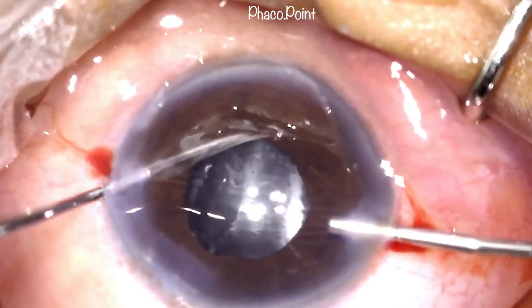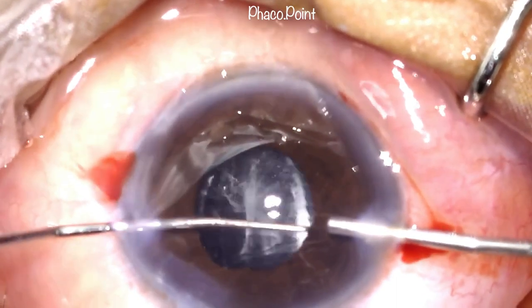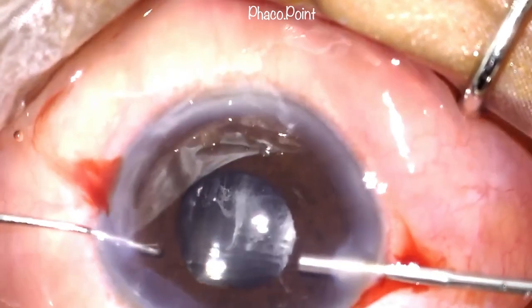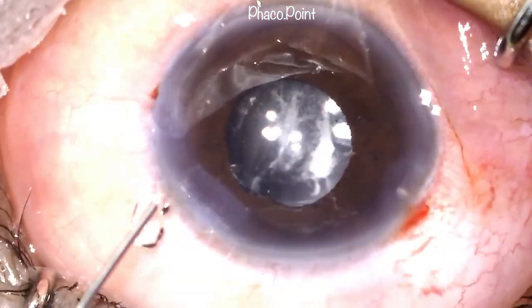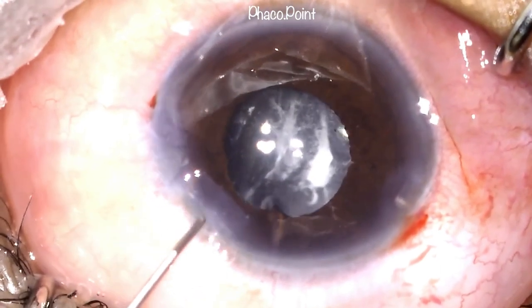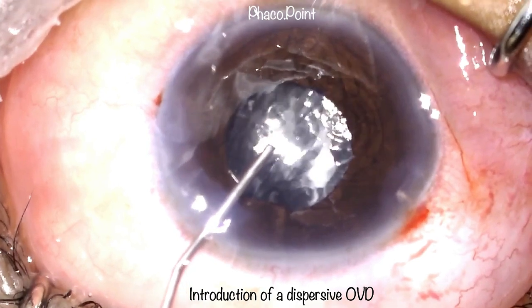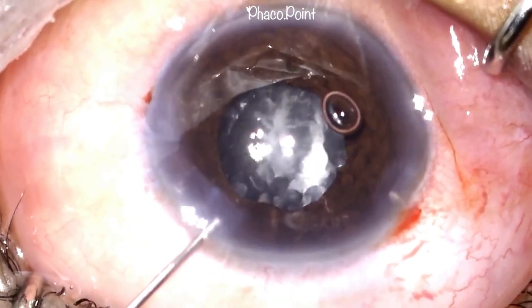I now proceed to evaluate how stable is this single-piece monofocal IOL, which still is within the capsular bag. In view of the significantly large posterior capsular rupture involving almost the upper two-thirds of the posterior capsule, a decision is then taken to explant the IOL.